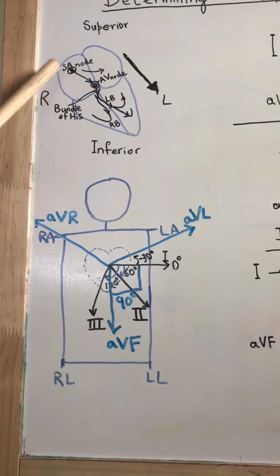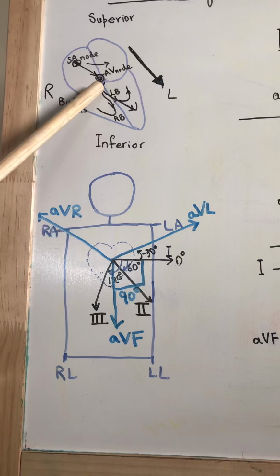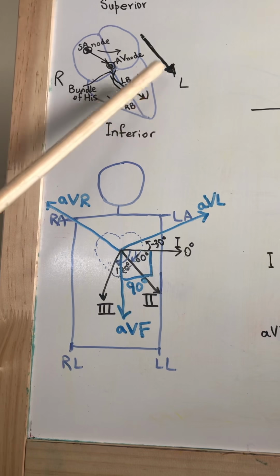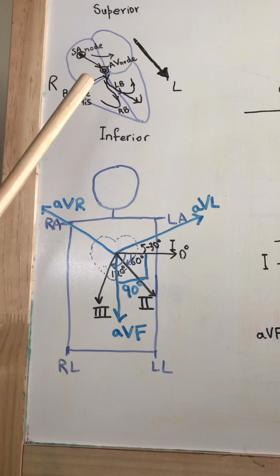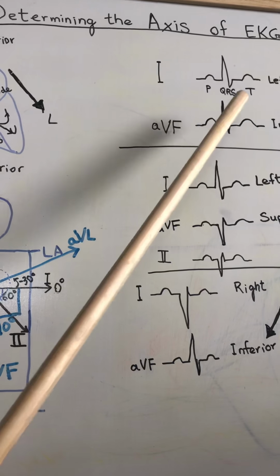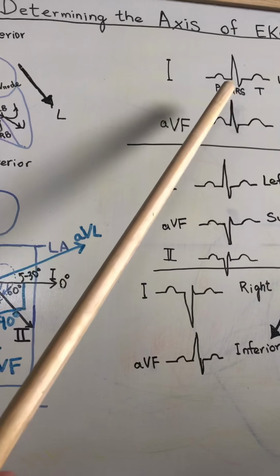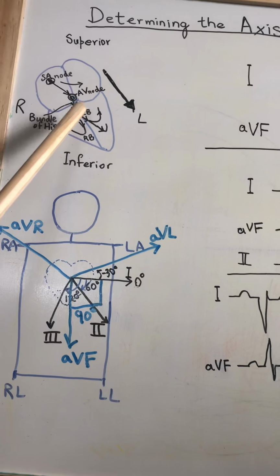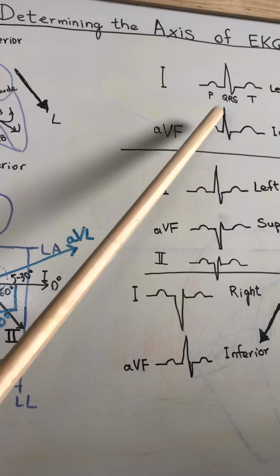The electrical activity of the heart is normally generated in the SA node. The electrical impulse travels down the conduction system, reaches the AV node, and then the bundle of His, and then is distributed to the ventricles by the bundle branches. The depolarization of the atria produces the P wave, and the delay at the AV node is reflected in the form of the PR interval, and the depolarization of the ventricles is shown by the QRS complexes.